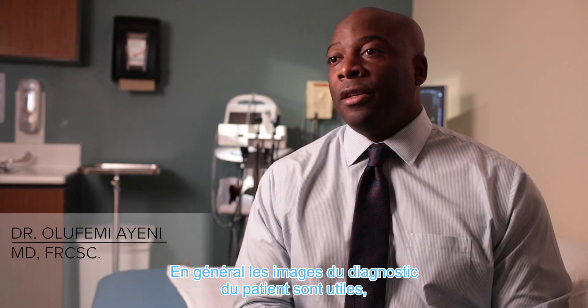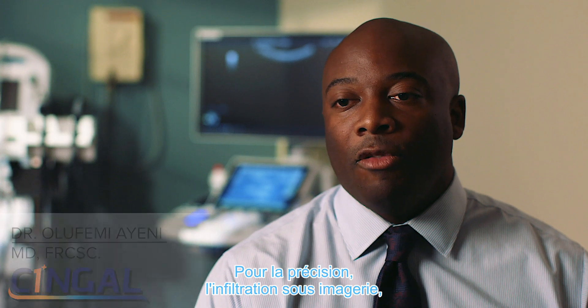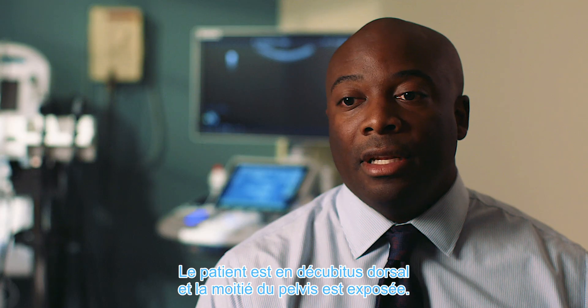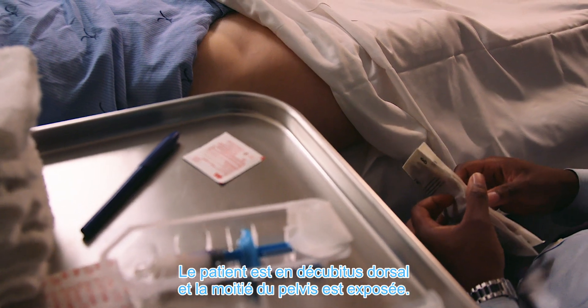Typically with the patient, image guidance is helpful, although landmarks are possible. For precision, image guidance helps — typically an ultrasound probe. The patient lies in a supine position on their back and the hemi pelvis is exposed.